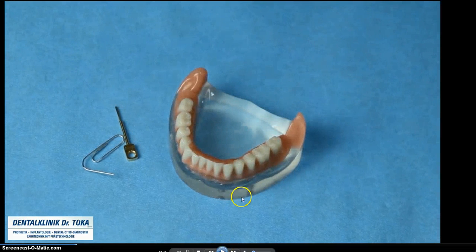It is a much better solution than a removable denture, because a removable denture has a palatal part, so it goes over the inside of your palate, this upper part in your upper jaw. But this here is only shaped like a U. Okay, so it's a lot smaller than a removable denture, and also when you chew on it, the force is only pushed on the implants and will not be pushed on the gum, so it is a lot more comfortable to wear.